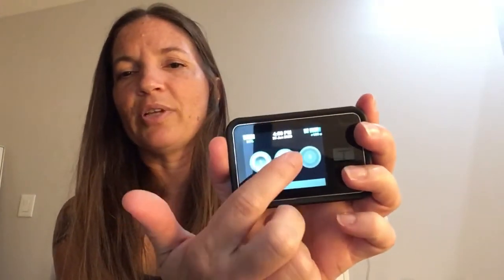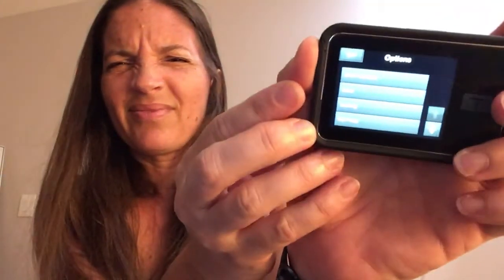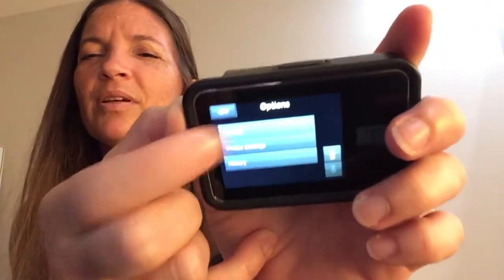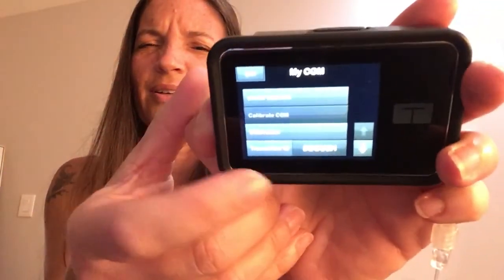On the pump it is equally as simple. I'm obviously not in Control IQ yet so everything is looking kind of drab, but here's my menu — I'm going to go to Options and go down to Transmitter ID. I do want to start the sensor but I can't start the sensor until I've updated my transmitter ID, so I'm going to touch Transmitter ID and enter it.